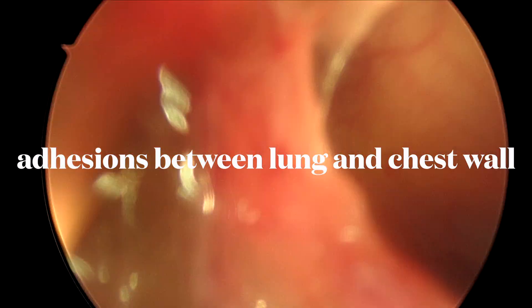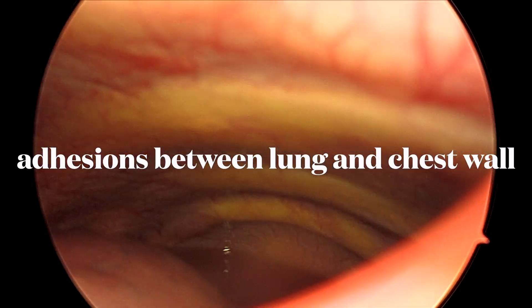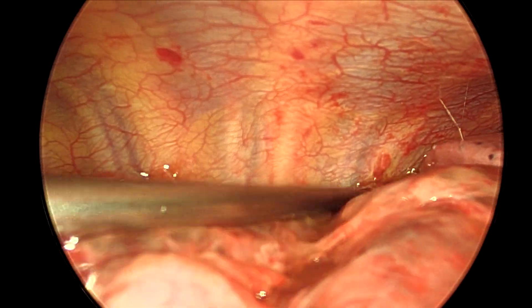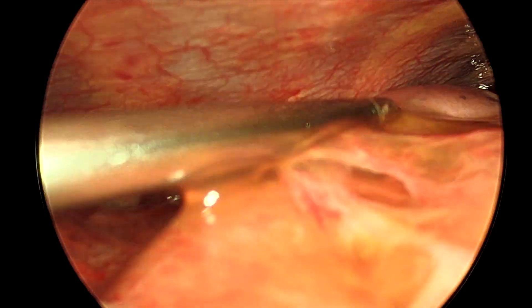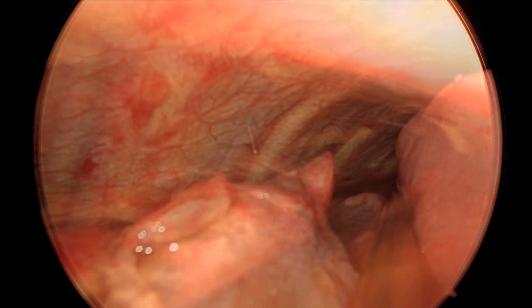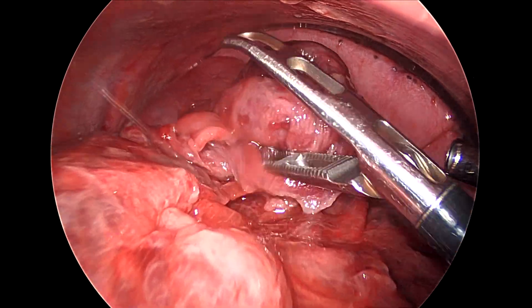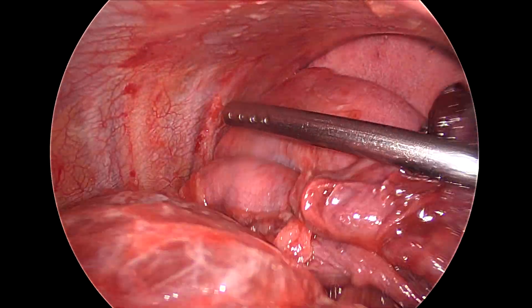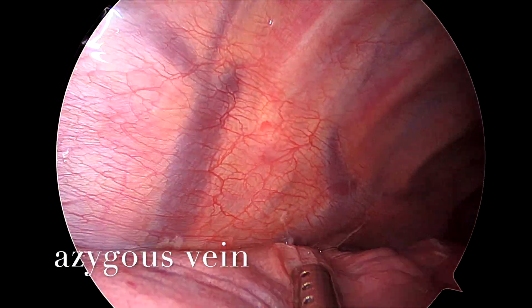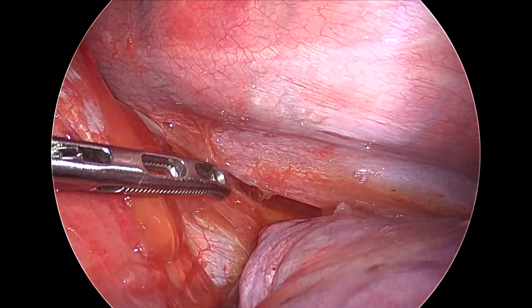On thoracoscopy, we can see that there was a significant amount of residual fluid within the pleural cavity. There was fibrinous exudate as well, because of long-standing chylothorax. The surgery was done at 8 days of the injury. After the fluid was sucked out, the pleural cavity was examined.